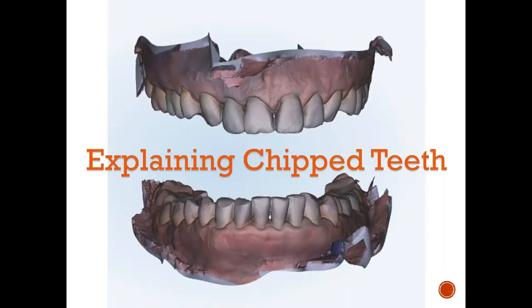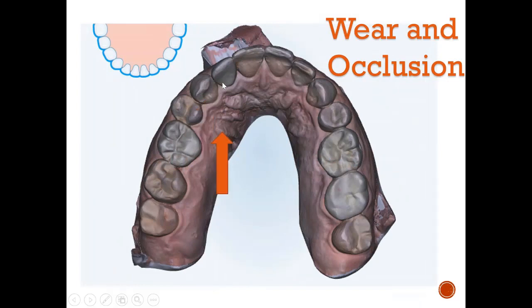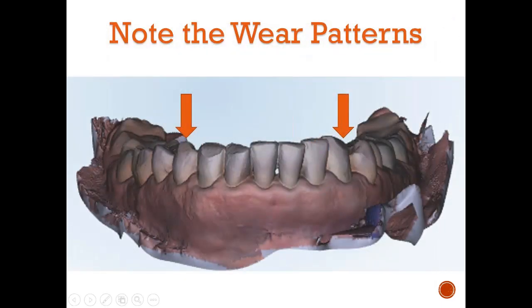And now I can explain why she has a chipped tooth. Look at the wear. Let's show you more. Look at the wear, and I try to show them the wear here, all the way here to the bicuspid. These are all zirconia monolithic crowns because she's fractured all her porcelain. Look at the incisal wear. I tell you, this is where iTero and other systems are just showing that there's so much more than just taking an impression. So I show the patient this. Look at her wear. How can you not believe that you're grinding your teeth?